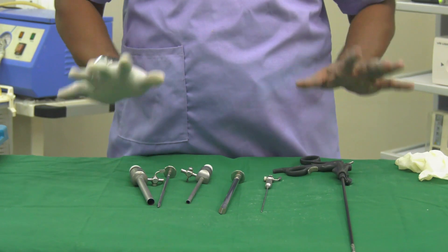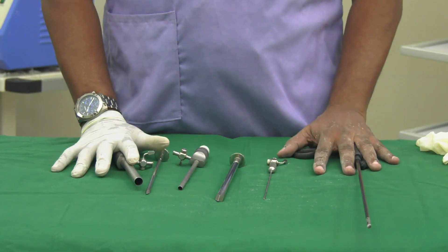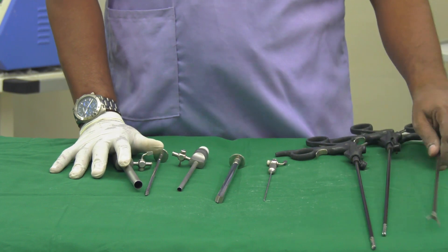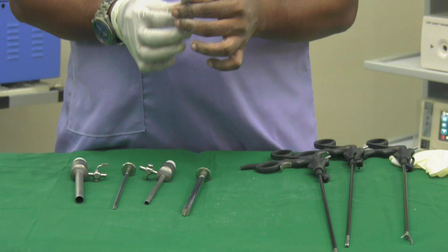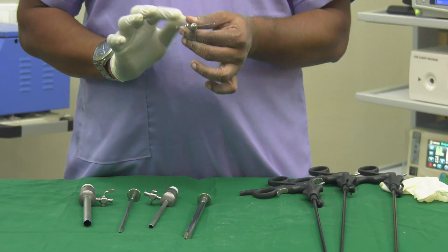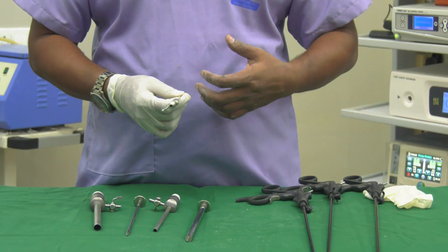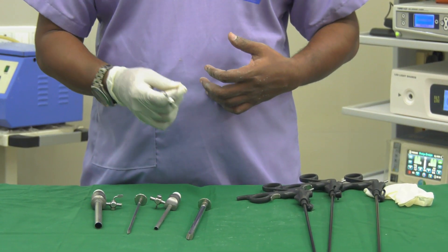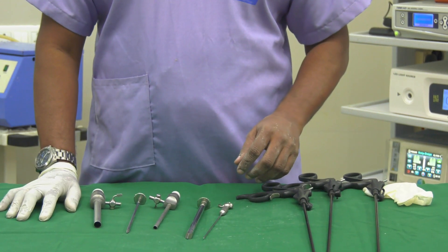Please don't forget the trocars and the Veress needle — these are critical for your exams. The Veress needle is a 100-times-asked MCQ. It is the first instrument we insert, near the umbilicus, to insufflate gas into the abdomen using the closed technique. Please remember all these points.